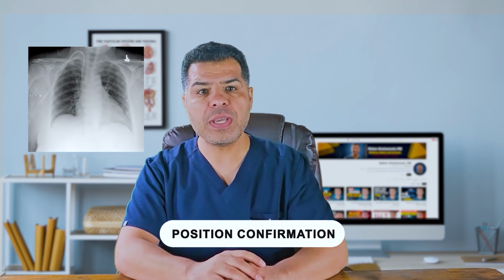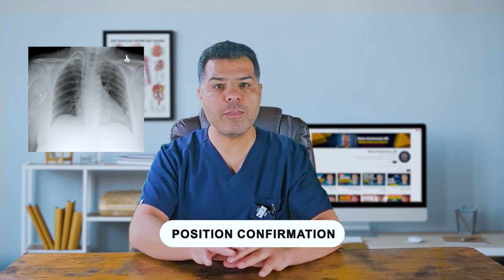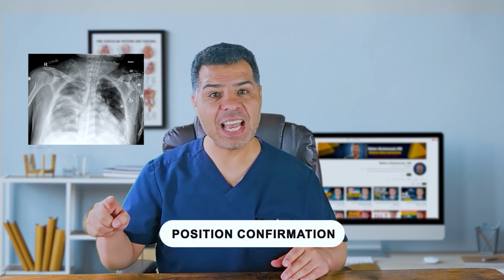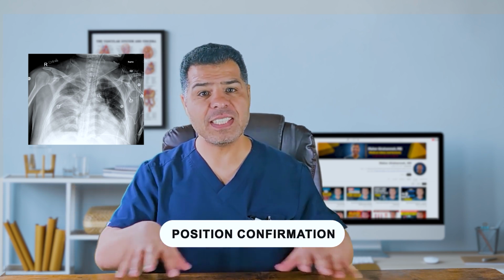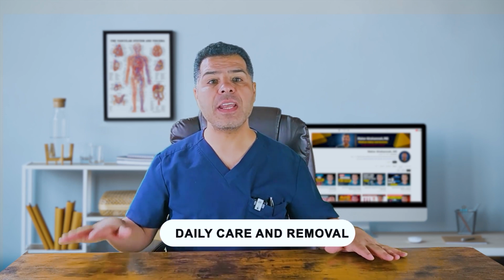On this X-ray, you can see a right IJ vein permacath with the distal tip at the cavo-atrial junction as well. On this one, you can see the right IJ crossing the midline, overlying the aortic arch. This line is not in good position and should be pulled back or removed. Let's talk about daily care and removal.